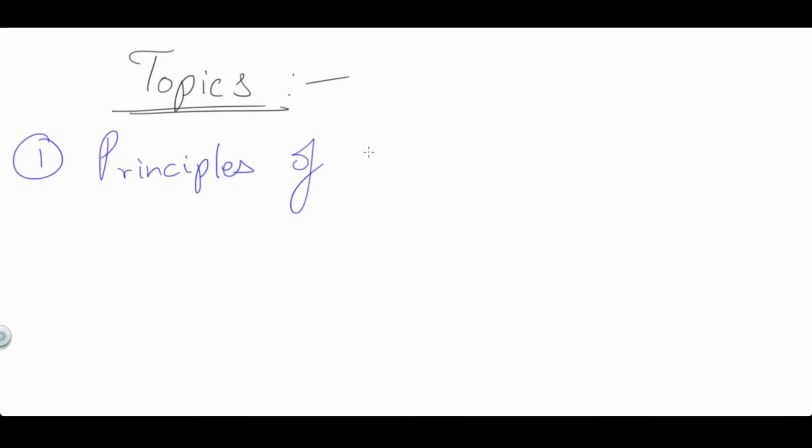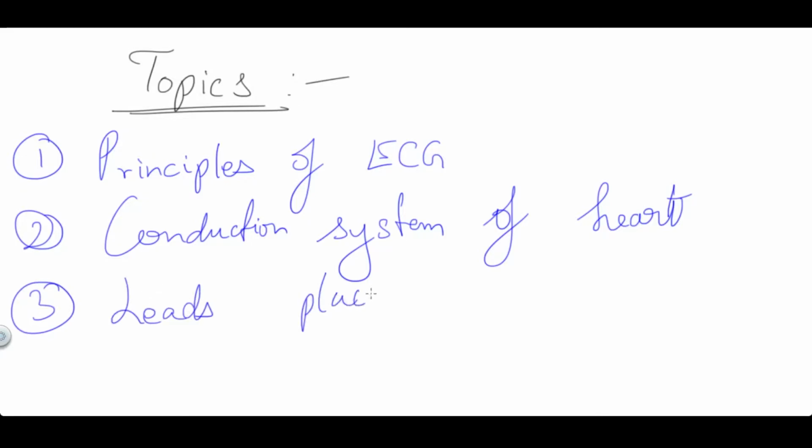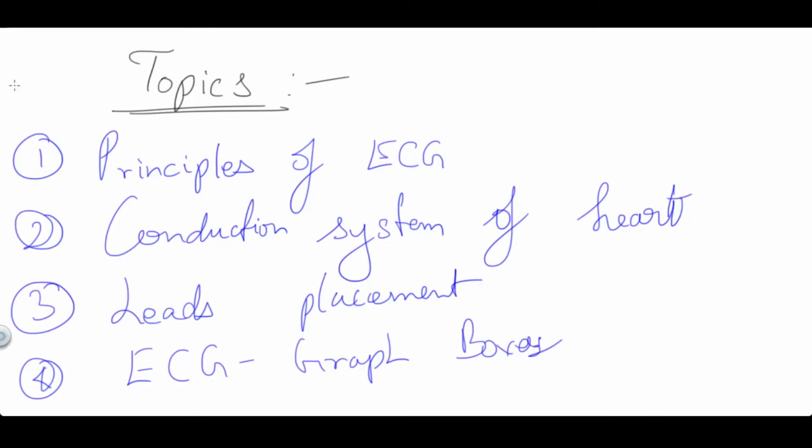Let's get started. So today's topic, we're gonna see about some principles of the ECG, and we're gonna learn about the conduction system of the heart and lead placement on the body and ECG graph boxes.